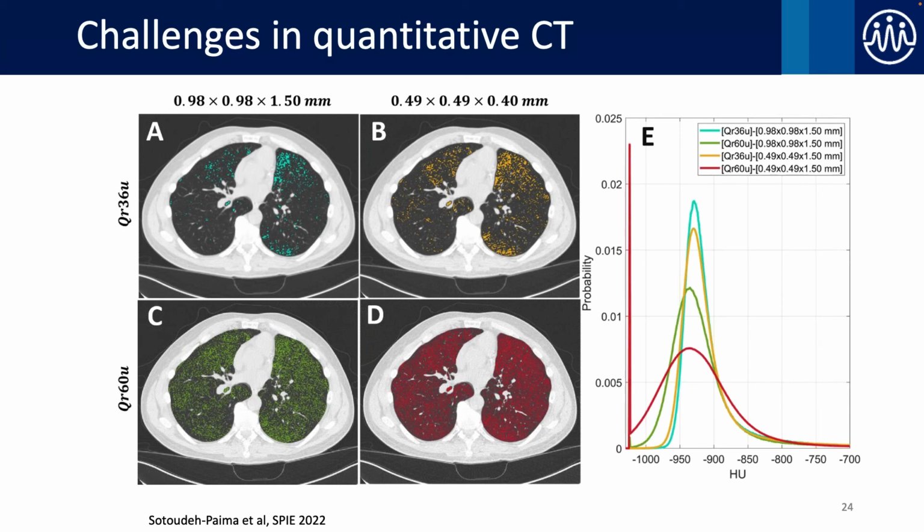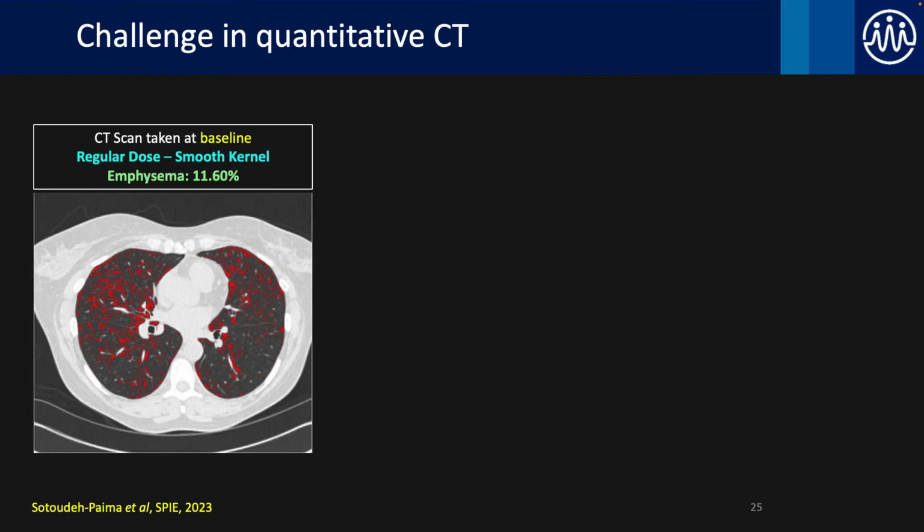And density in the lung is a very predictive attribute that we want to quantify. On the right, I'm showing you the plots of the histogram of these images. The histograms are from the same patient, and ideally, they should reflect the disease severity of the patient, not the scanner or the condition. But as you see, the histograms are very different, and the only difference is that you use different imaging conditions. So that's problematic, because as I said, your quantifications are affected and impacted by those settings, and this is something you want to avoid. Let me give you another example.